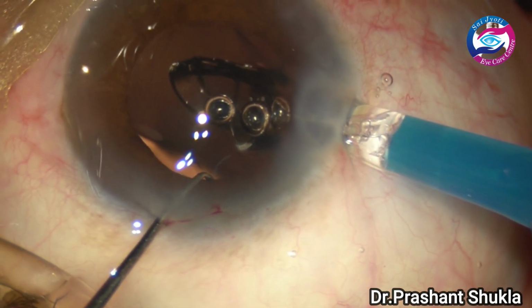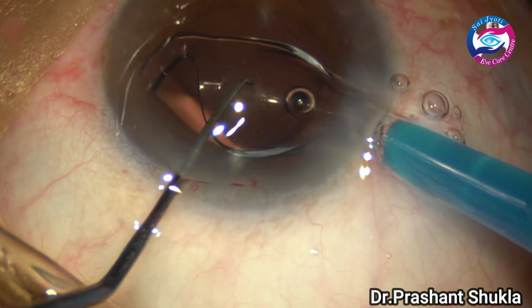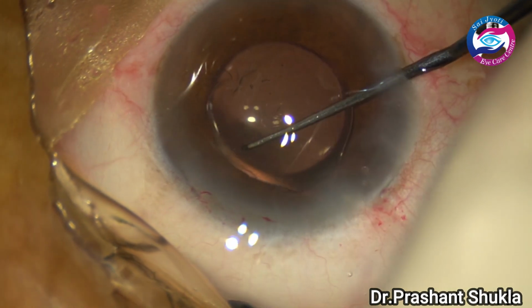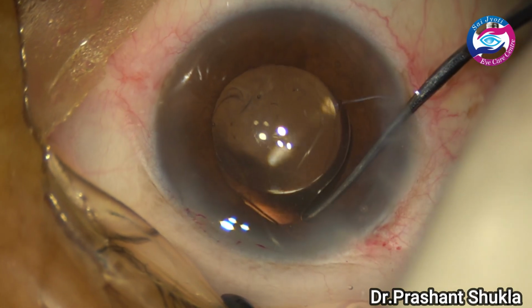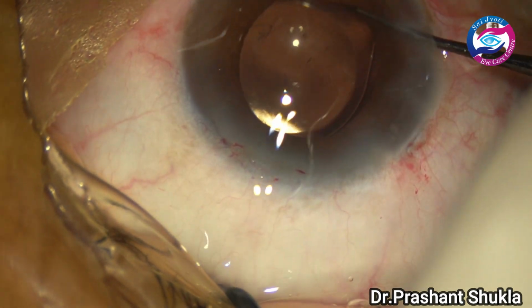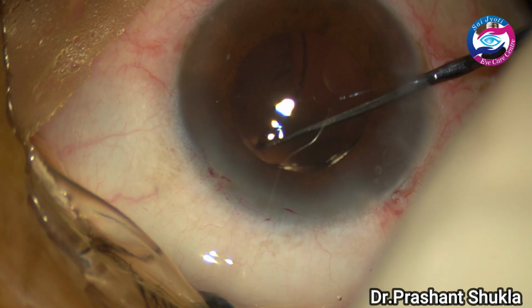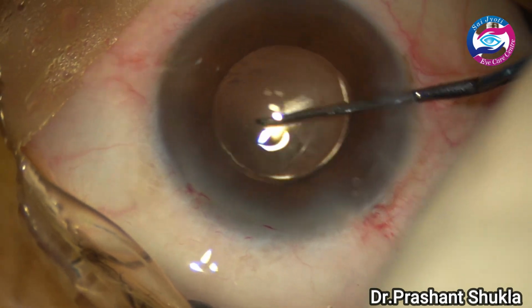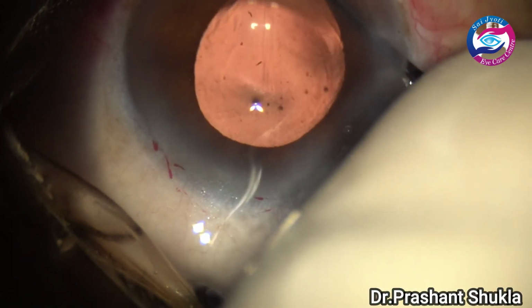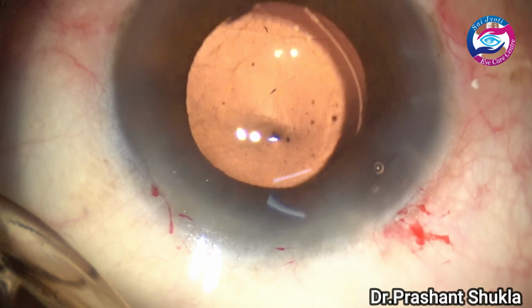After filling the bag with viscoelastic, a single piece monofocal foldable hydrophobic aspheric lens is being implanted into the eye. One haptic goes in the capsular bag, the other one is also dialed into the capsular bag. But as soon as I dial the other haptic, I feel that the lens is not very well centered and it's moving towards the left side. So with the Y hook I am just checking whether the haptics are in the bag or not, and the lens is towards the left side as can be seen.